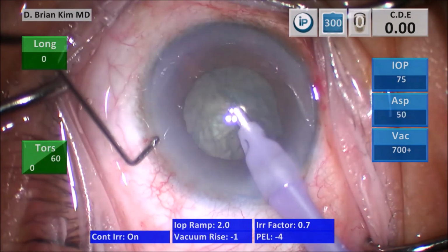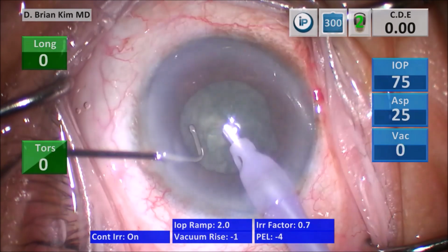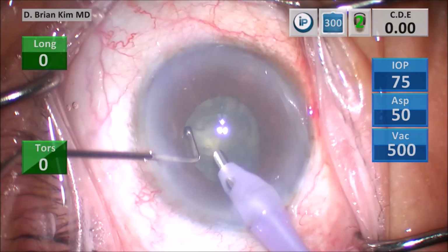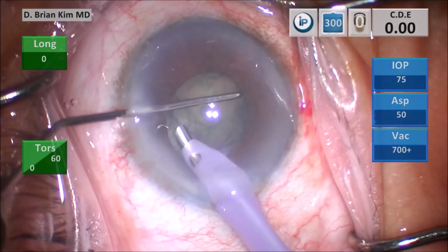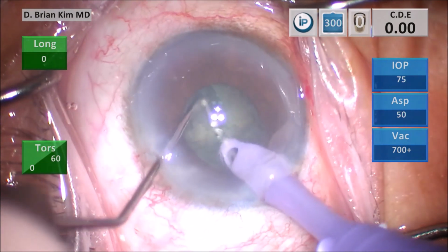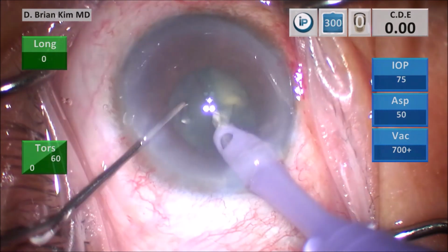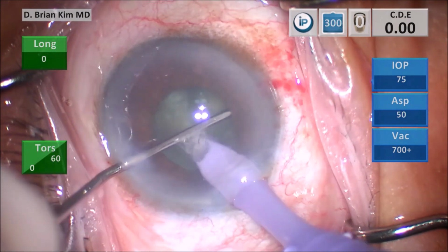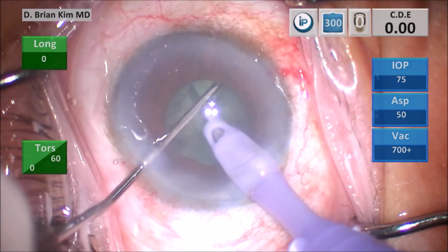I place the chopper out to the contralateral equator, and then I rotate my phaco-tip vertically, and I go subincisionally, and I stab the lens, and then I bring both instruments together, crushing the girth of the lens. Again, this is a very safe technique and zonular friendly because all the forces are oriented towards the center. I'm able to chop the lens very efficiently.